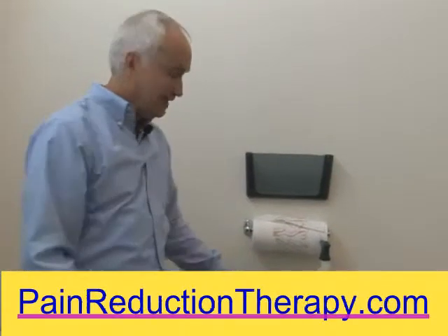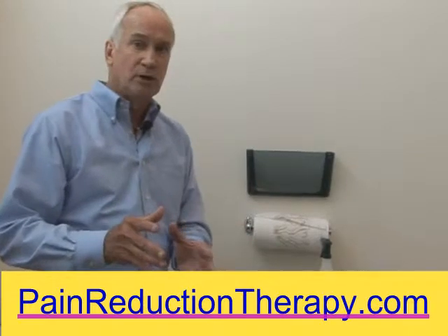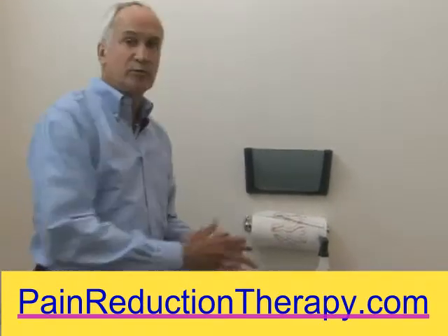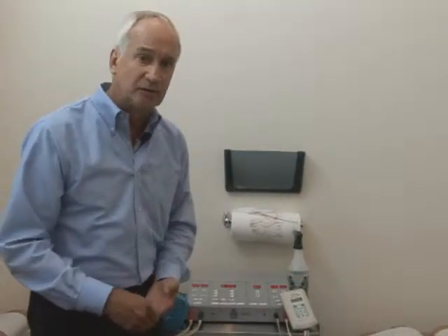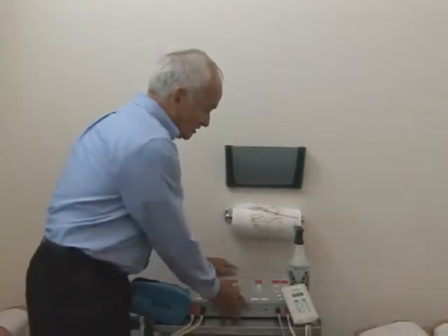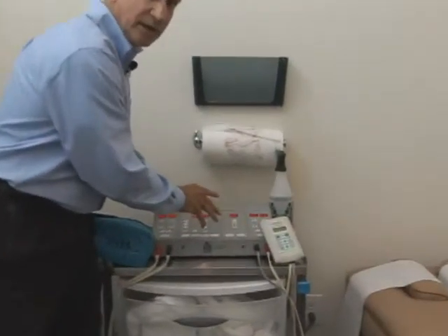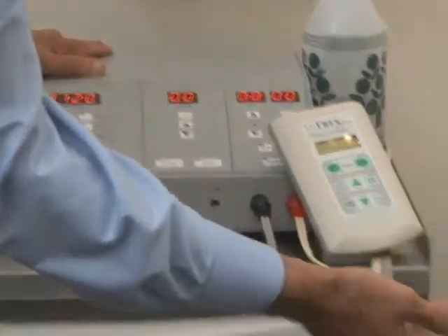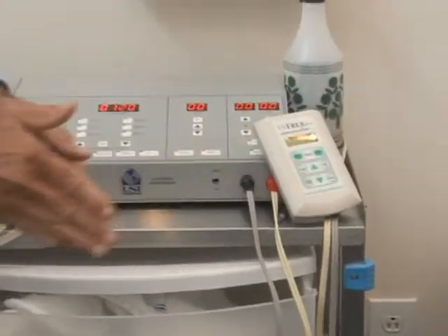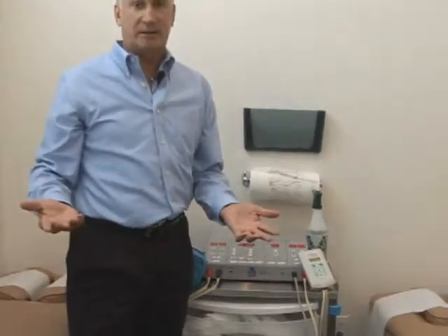And what we want to do today is to try to help you understand if you've already received an interferential treatment. Because many people will go to their physical therapist, the chiropractor, their medical doctor, the pain clinic, and they will get a treatment. And all they know is there was a big unit with a lot of lights on it, sometimes a few bells, and they were hooked up to some wires. And they received this electrotherapy treatment that made them feel better.